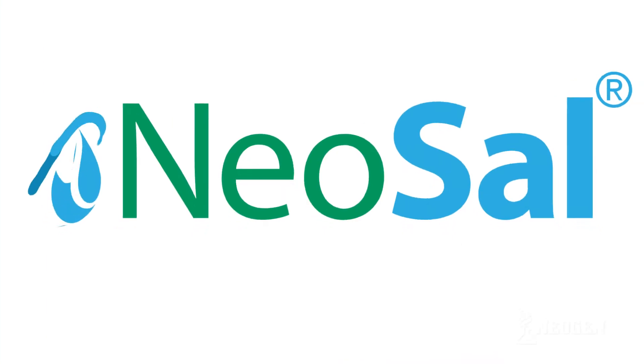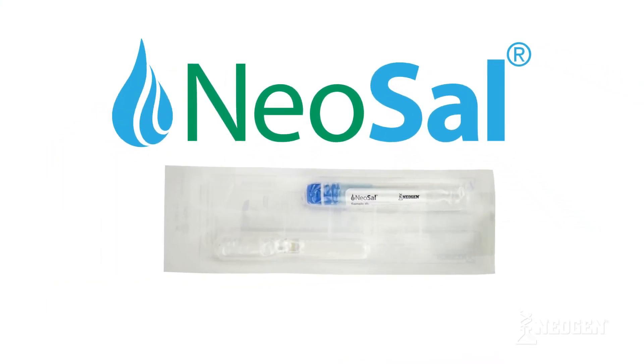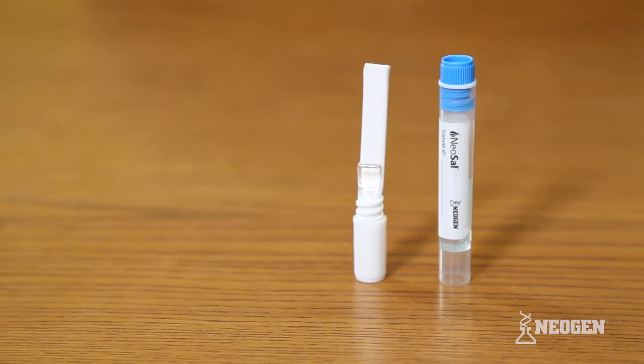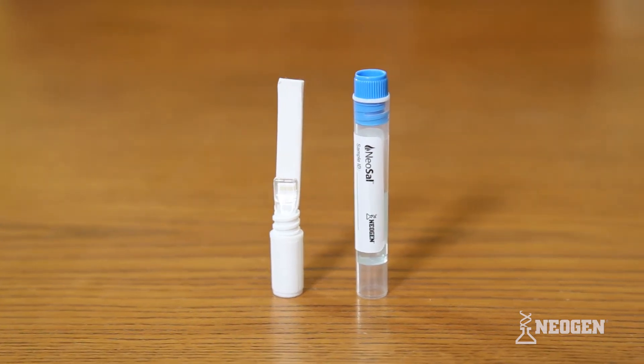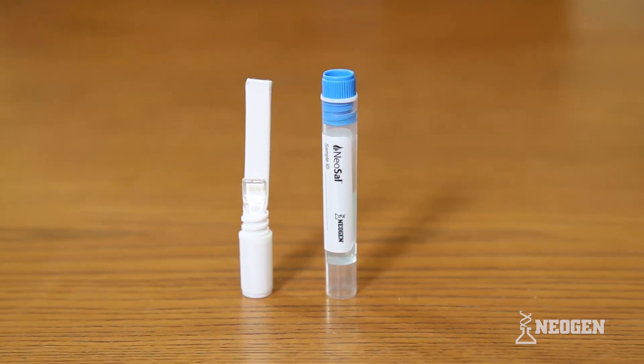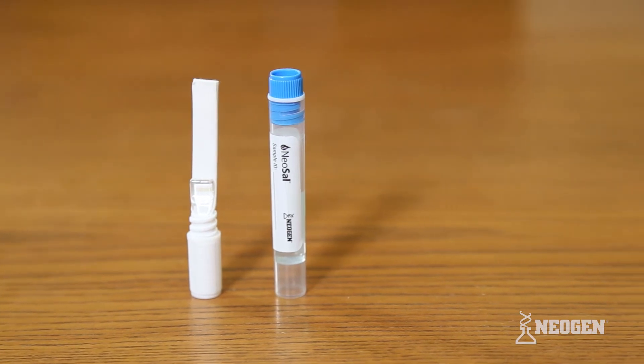The NeoSal Oral Fluid Collection System is an easy-to-use oral fluid collection device for laboratory-based drug screening. The NeoSal's unique design features allow for maximum ease of use when collecting oral fluid samples and ensure stability of the sample prior to laboratory testing.